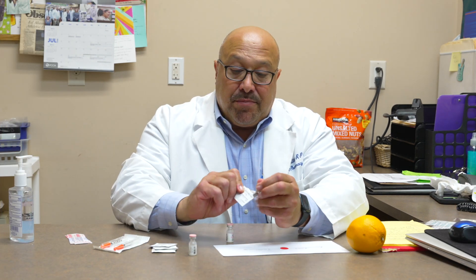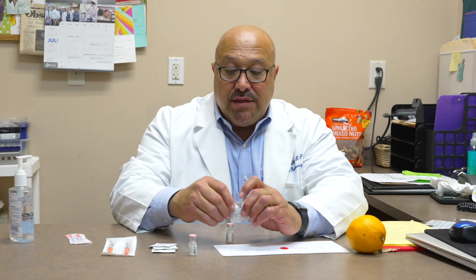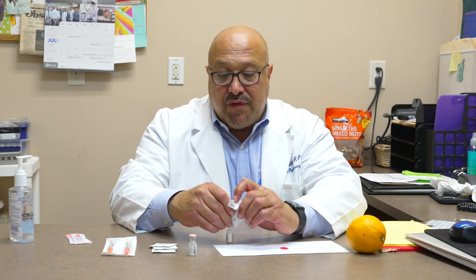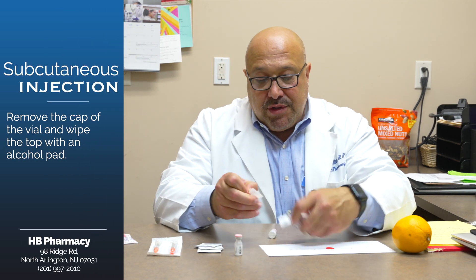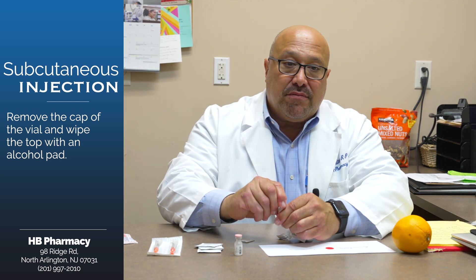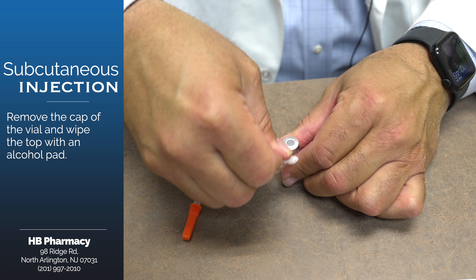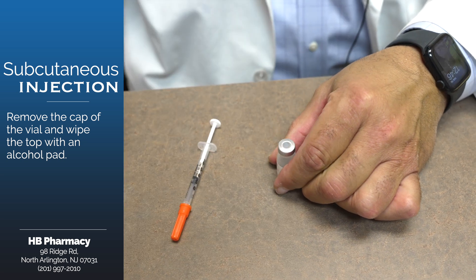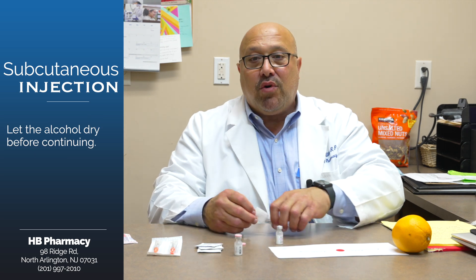Our next step is to prepare our vial. Some medications will come in a vial; some will come in a pre-filled syringe. In this case, we're going to first start with the vial. You're going to get one pad out, remove the cap — there'll either be a foil cover or a flip top — and carefully wipe it. It's always important, whether on your skin or on top of the vial, to allow the alcohol to dry.